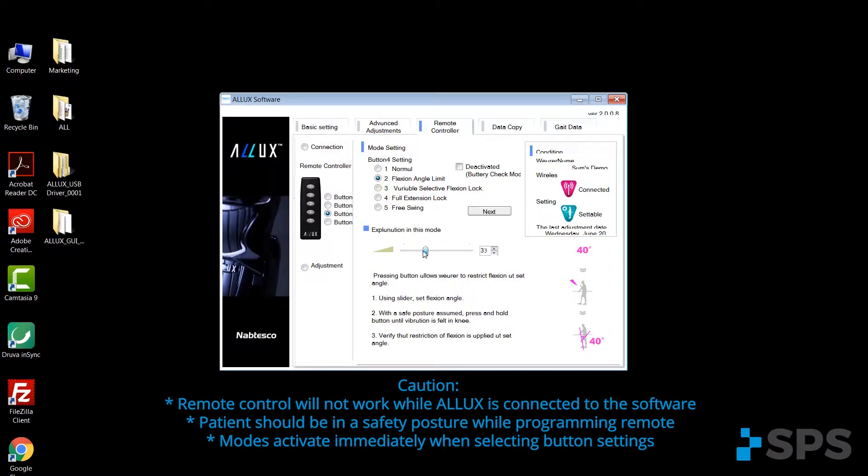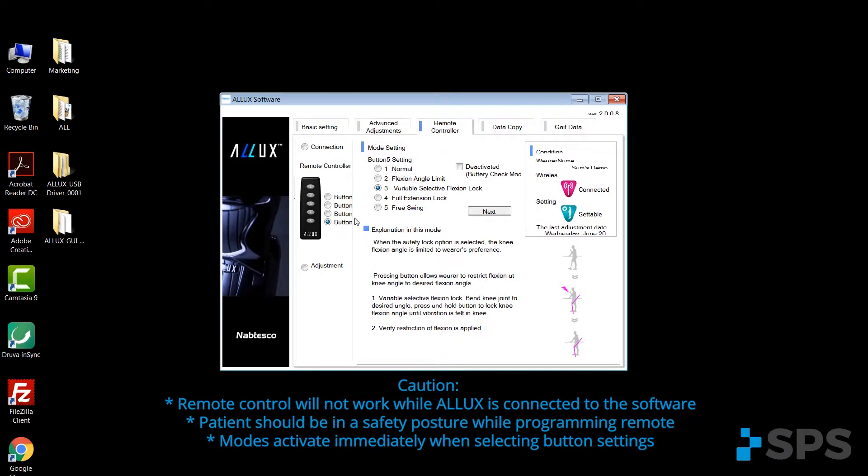When selecting the flexion angle limit, you use the slider to set the angle lock when that button is depressed. On variable select angle lock, when that button is depressed by the patient, they would move the knee into the flexion angle that they would like to achieve, press the button, wait for a vibration of the knee, and then they would be locked into that flexion angle until they depress button number one, which returns them always back to normal ambulation mode.